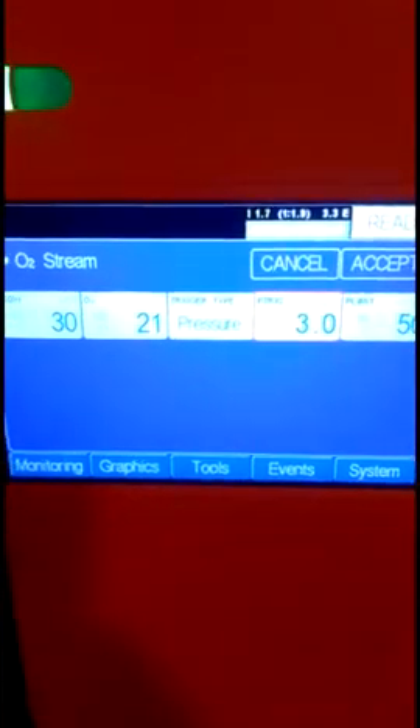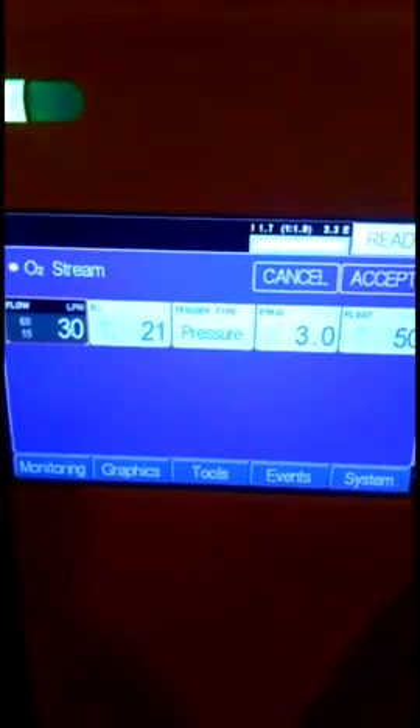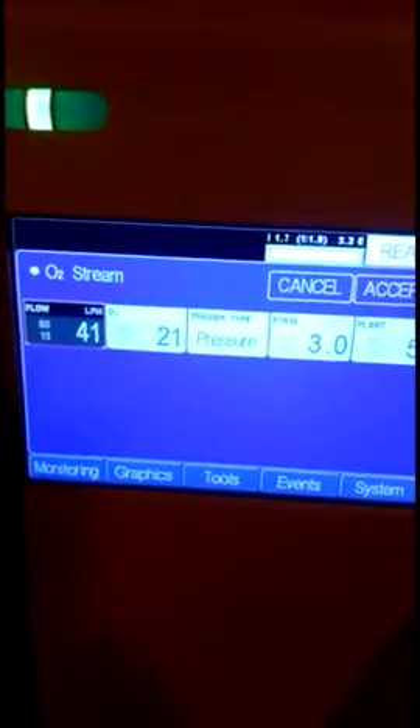It also has an O2 Stream facility, which is high flow therapy. This is provided as standard with the ventilator. You can set the flow to be delivered to the patient up to 60 liters per minute.